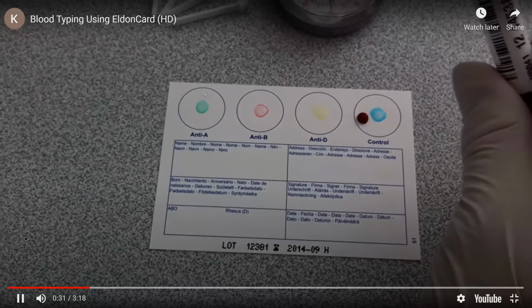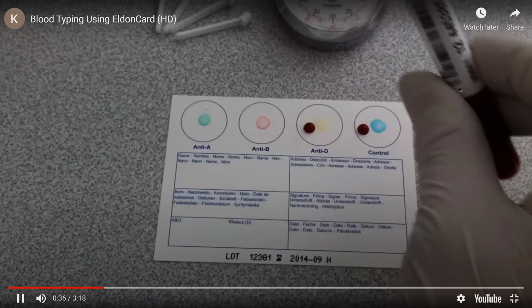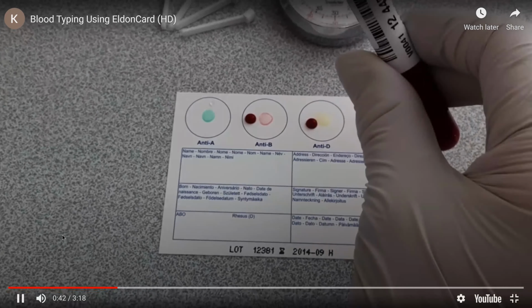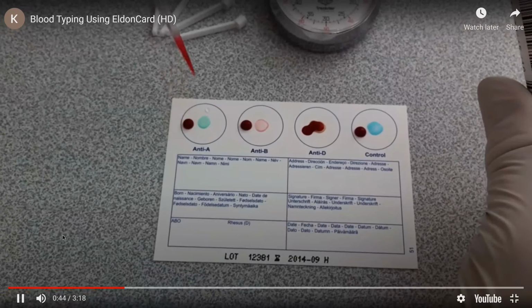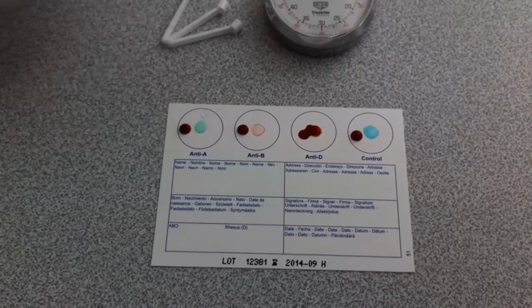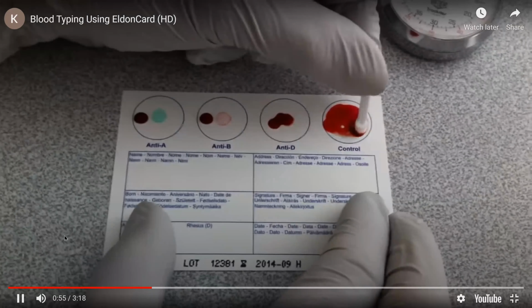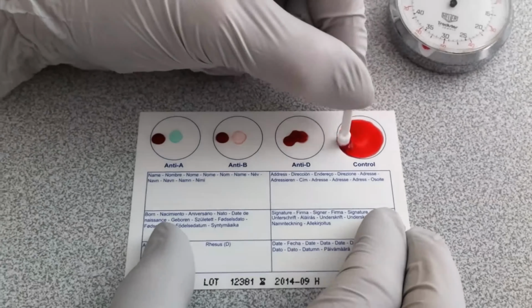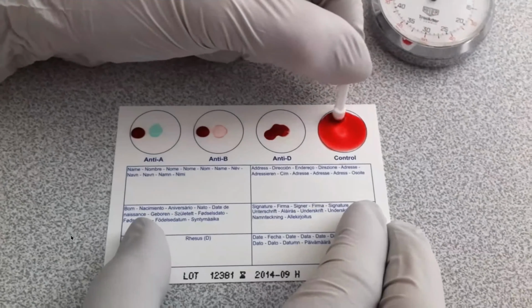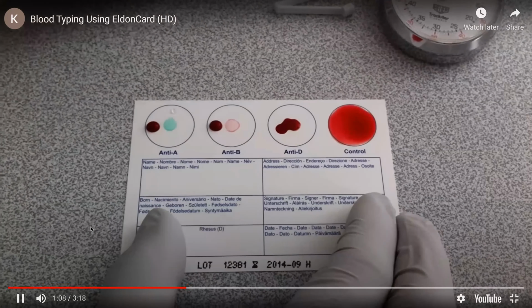Warning, blood is being shown. So 1 drop of blood, like they mentioned, from the same sample, same blood type, same person, is being added to each of the antibody solutions. Now what the person is doing is combining the control saline solution with the blood to make sure that there is no agglutination happening, and this test is valid.